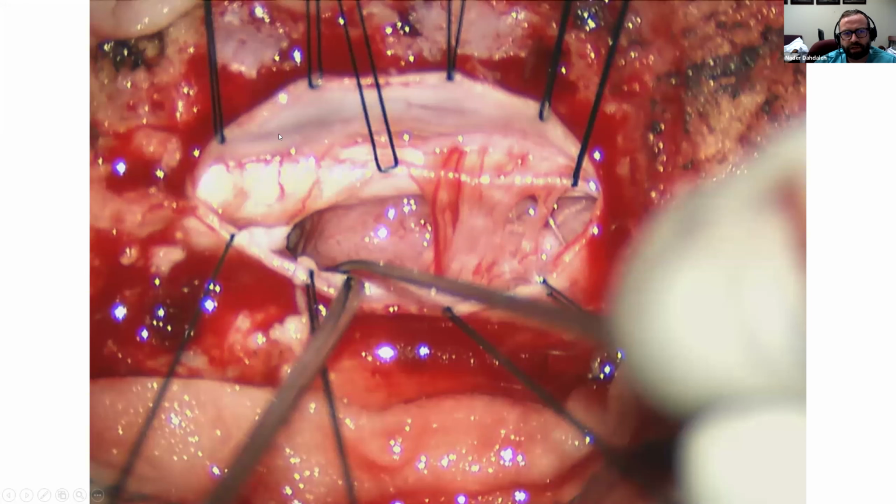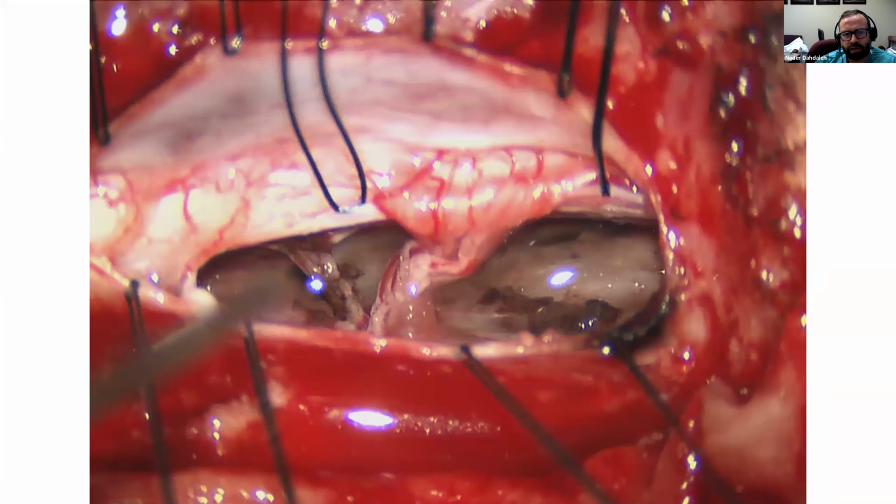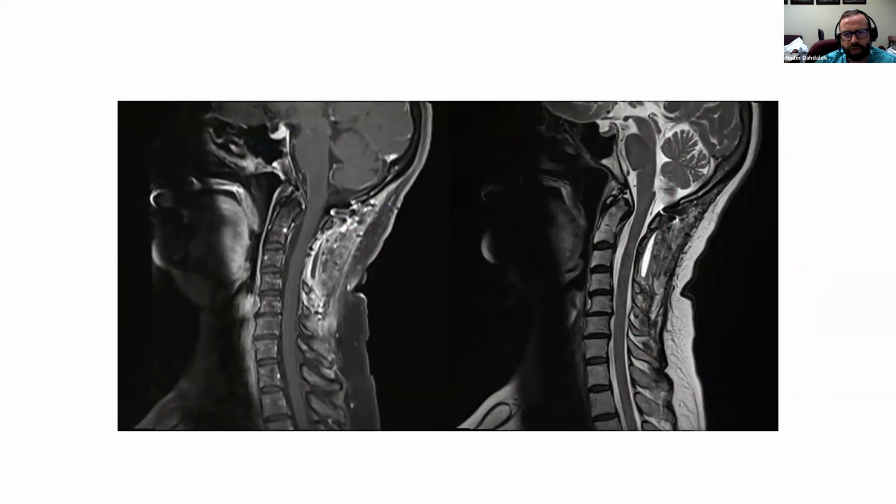So just a C2 laminectomy, maybe partial C3, a little bit of a medial facetectomy. And you can see here, the dura is tented with these stitches. You can put a little stitch in the dentate ligament, as Jonathan alluded to. That's your C2 nerve. These days I would sacrifice it. Before I wouldn't. And then you look at it, and definitely I want to remove it en bloc. It's ventral to the cord. So Jonathan said, you use the CUSA, easy, take the tumor out, then stitch it back. And no instability, long-term outcome was good. And the pathology was a meningioma.